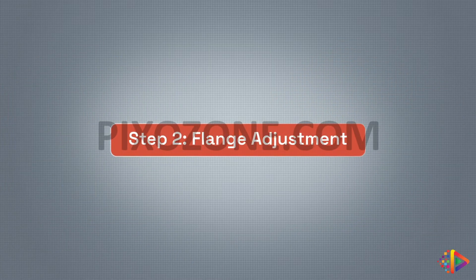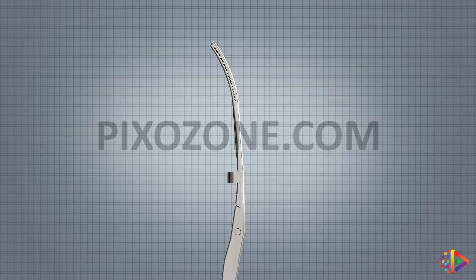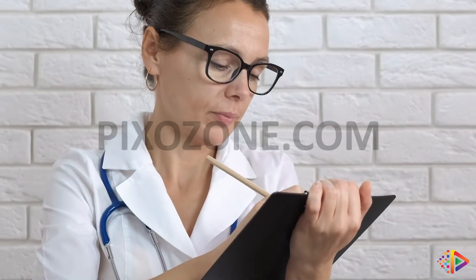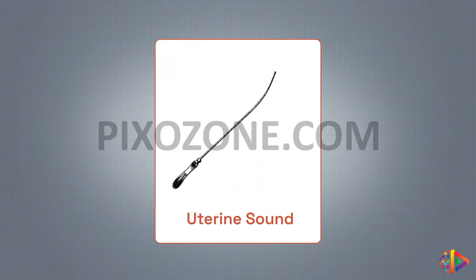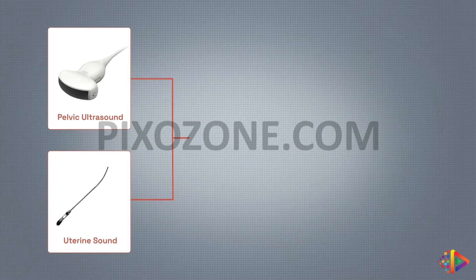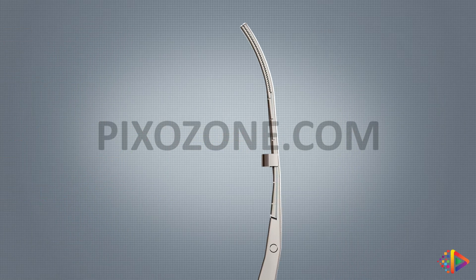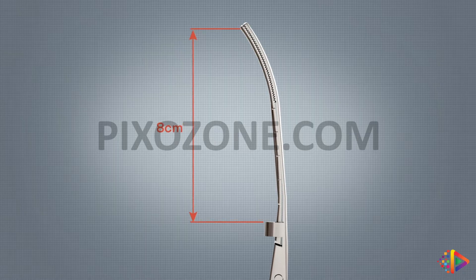Step 2: Flange Adjustment. The IUD remover features an adjustable flange designed to accommodate the patient's utero-cervical length. To adjust the flange, use the patient's recorded utero-cervical length from previous measurements as a reference. If no prior measurement is available, you can use the uterine length from the pelvic ultrasound. Subtract 2 cm from the previous utero-cervical length or uterine length shown in the ultrasound. The flange's maximum adjustable length is 8 cm, a safety feature that helps prevent excessive advancement of the device into the uterine cavity.